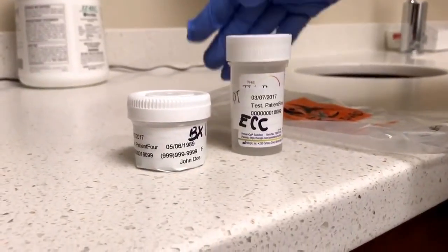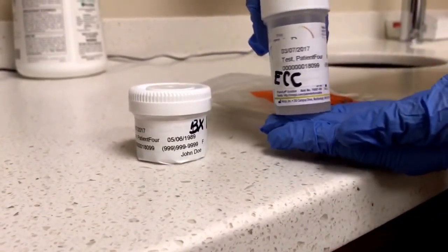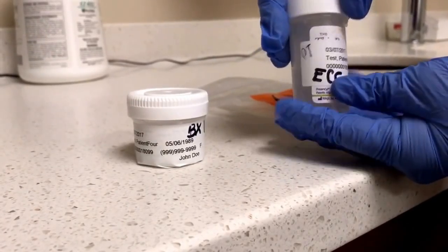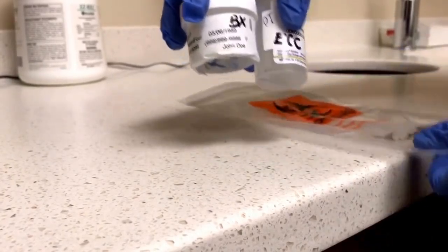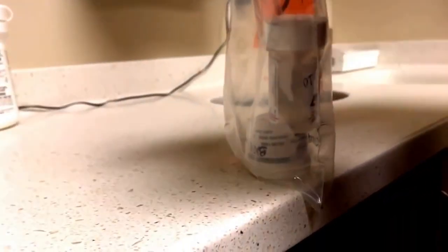After the procedure has been completed, verify that the label is on there and initialed. Make sure you have 'ECC' written on the first vial and the biopsy location written on the second vial. When that has been completed, place it into the bag and print off the requisition when it is ordered.